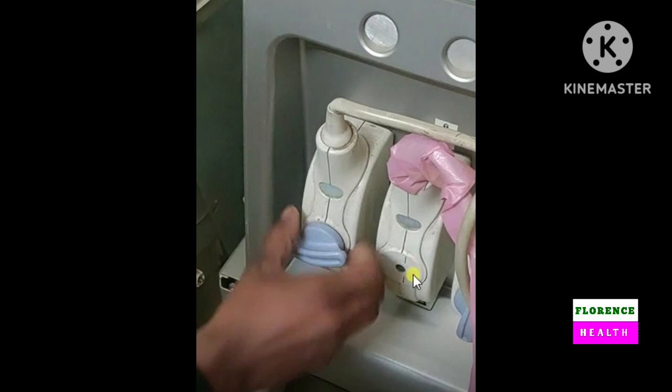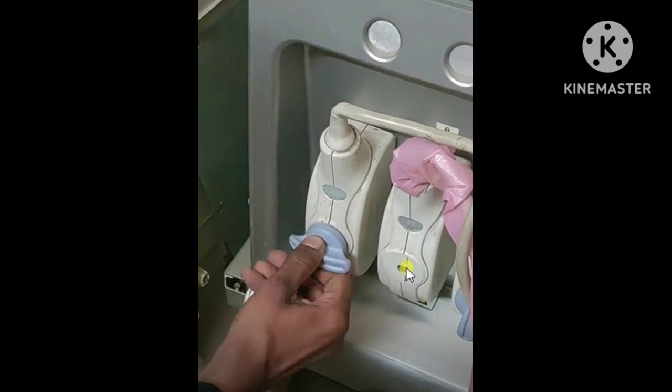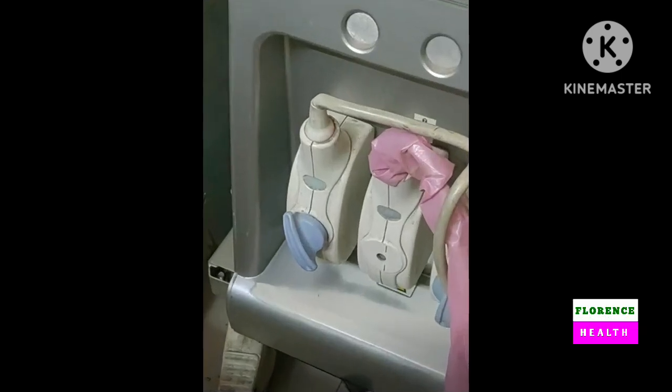Clockwise rotation of the knob and tighten the knob. Entire process should be slow, gentle and steady, otherwise you will be in problem always.